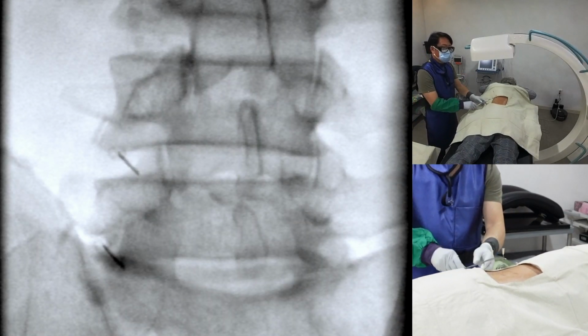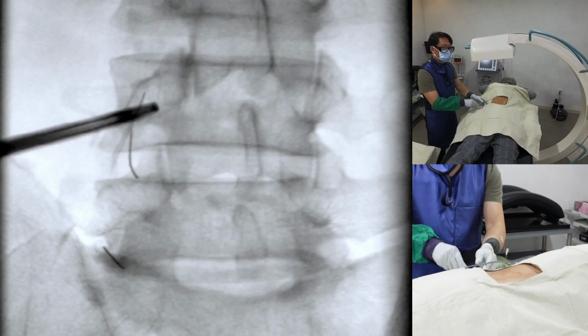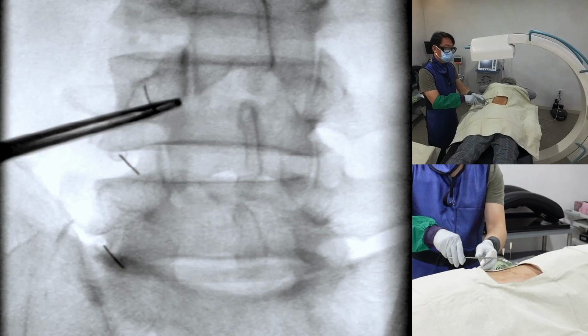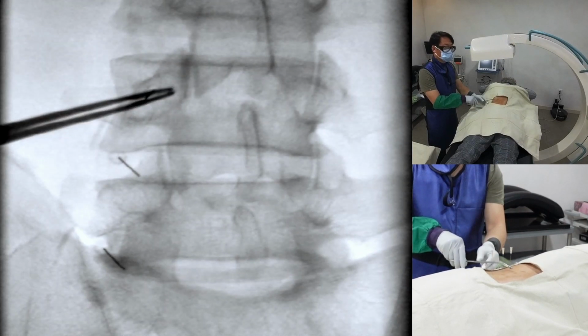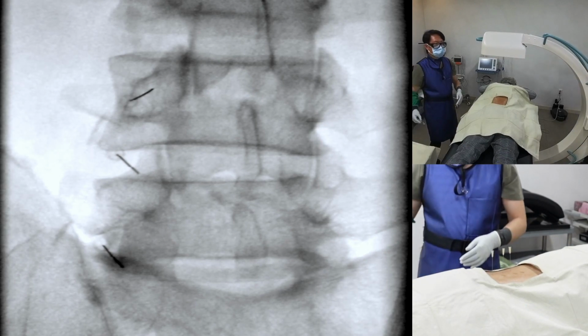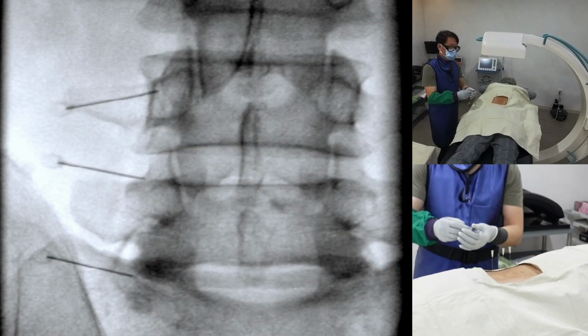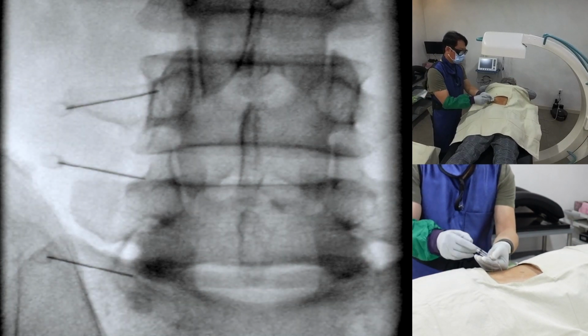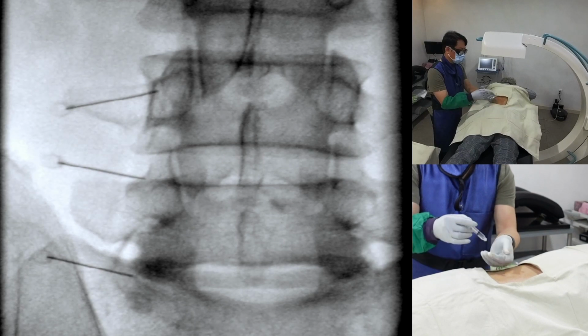Needle advancement: advance each needle toward the target medial branches until you touch the bone using long forceps, such as placenta forceps, to protect your hands. Needle positioning: once the needles are in place, reposition the C-arm into the AP view to verify that the needles are in the correct locations for the medial branches of L3, L4, and L5 on both sides.